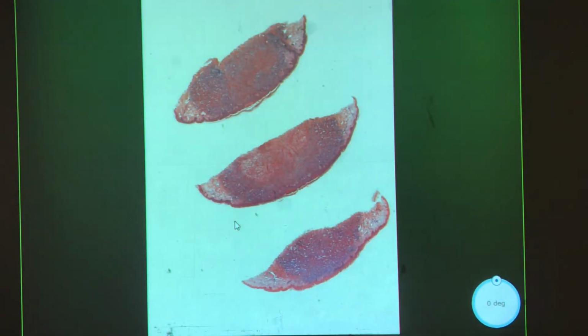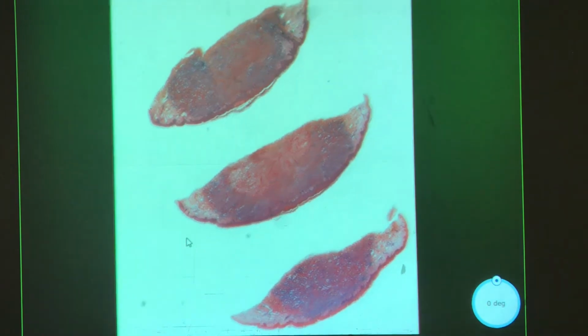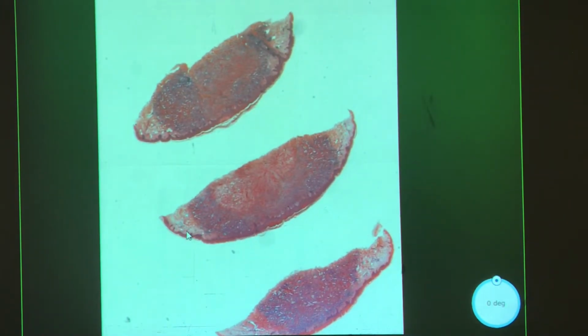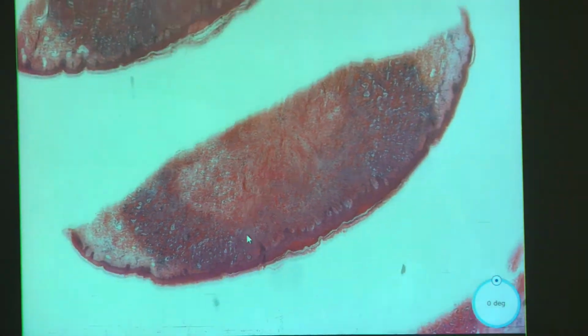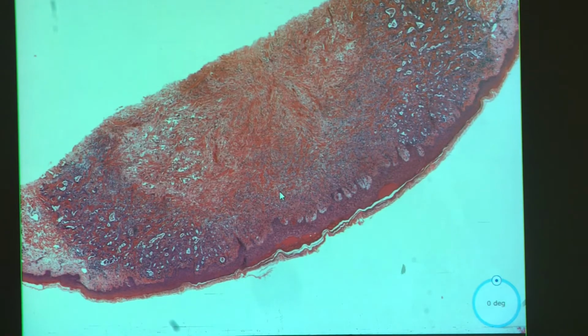Okay, malignant lesions. So the caveat to this is this patient presented with a skin nodule. So this is a skin nodule. So what is the history? Because I know you're going to zoom in on this and you're going to be like, what? Skin nodule. Yes. Unfortunately, there were no primary locations of this, so I had to go for metastasis. Oh, okay. So this is from skin. Yes. I see. I was looking, I was like, this is a very weird biopsy. I know, I'm sorry.